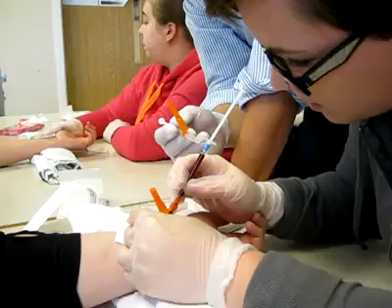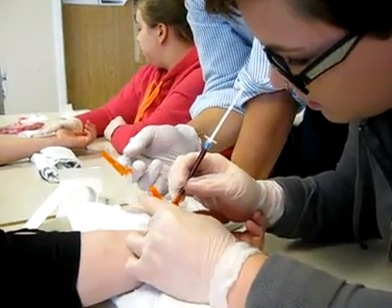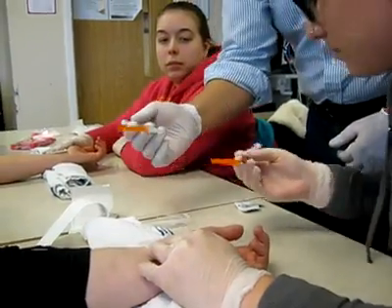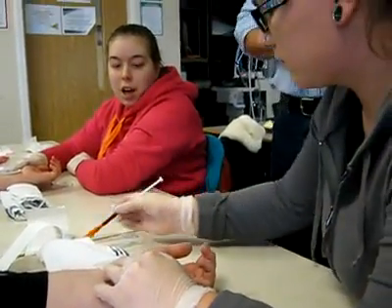That's awesome. Let it fill right to the very end. Good job. Straight out. Arterial blood. And press hard on that. Hold this needle over. There you go. And just snap it in place. Good job, guys.